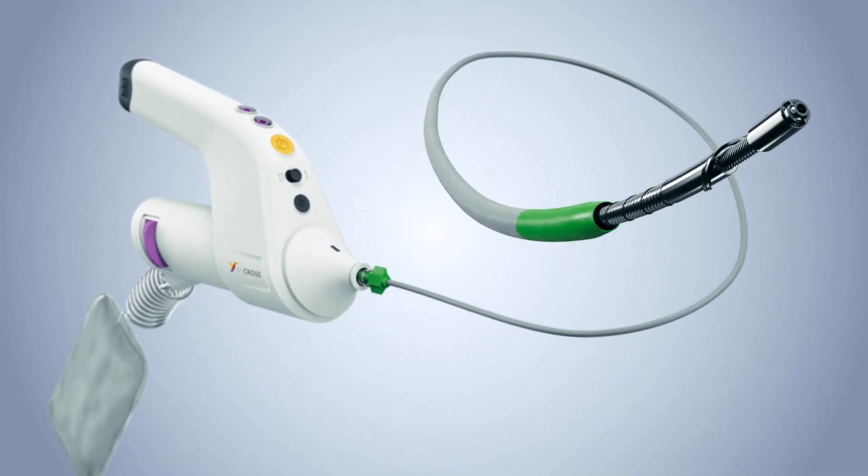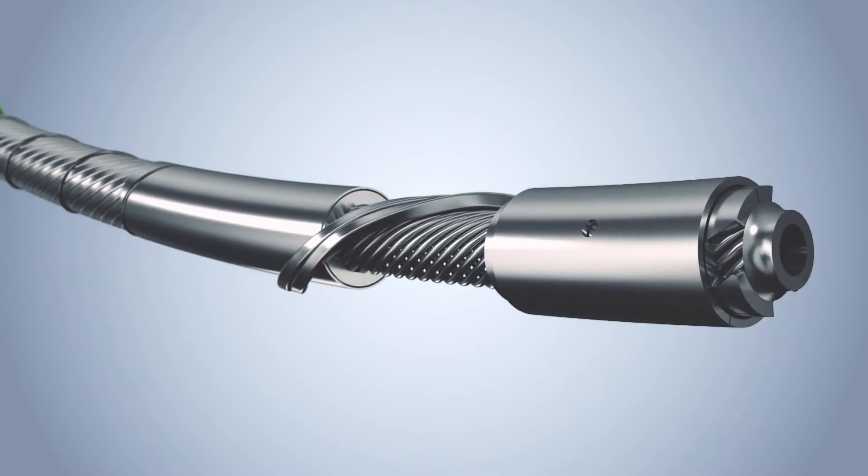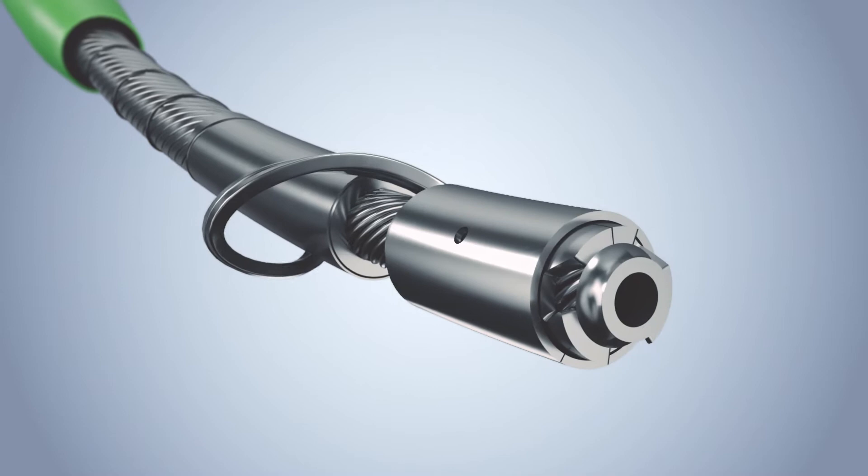The device's coaxial flexible rotating shaft has an expandable tip with an elastic arc that can bend and enlarge its diameter.